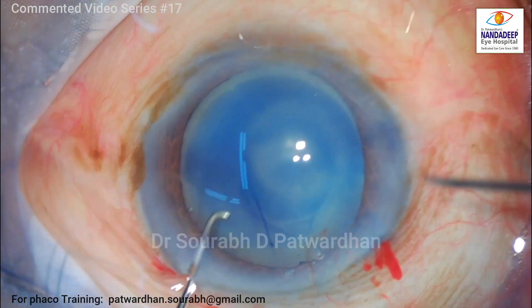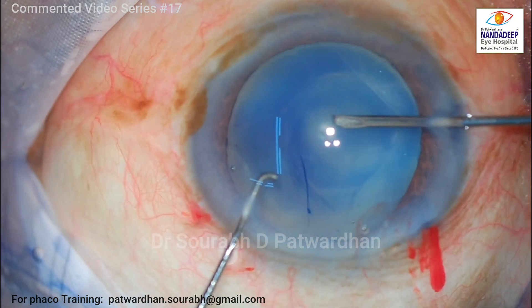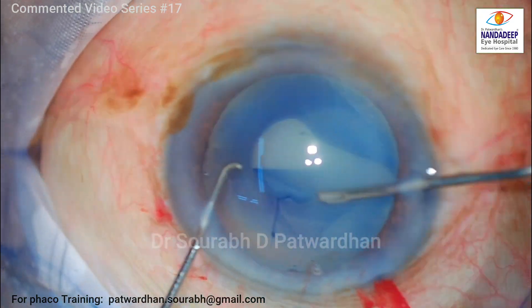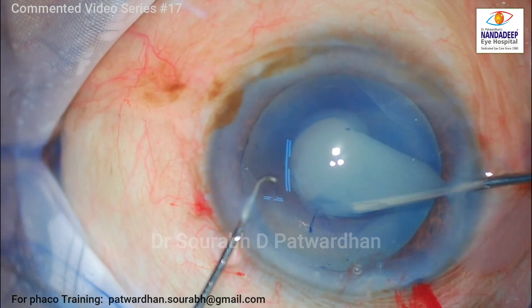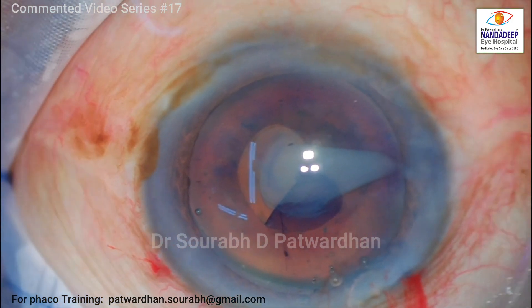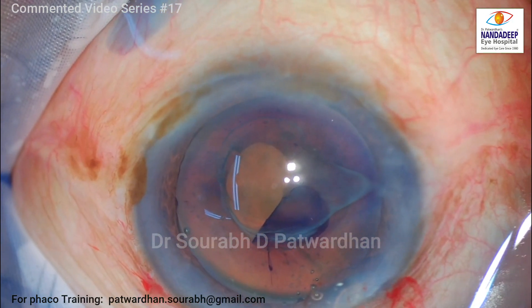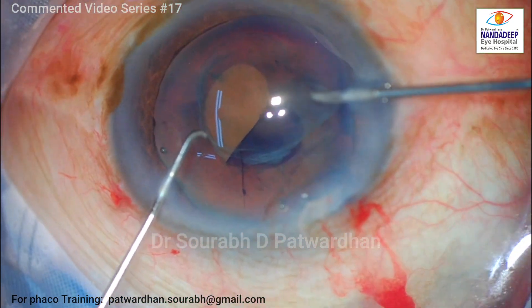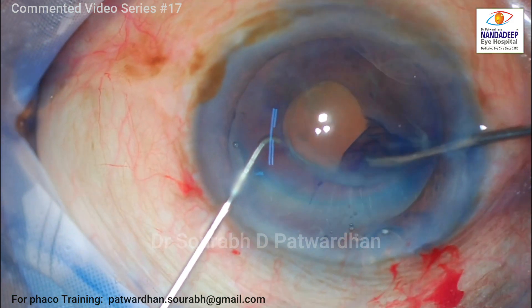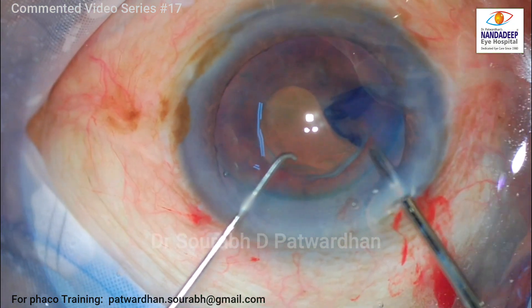The anterior capsule is well stained with trypan blue and I am starting off with the capsulorhexis using the bent cystitome of 26 gauge. As I make the first nick, as I expected, there is this milky fluid which starts coming out. I am not worried about the Argentinian flag sign here — just have a look: the cataract has turned from white to amber in just a matter of seconds. So that's the real colour of the cataract.